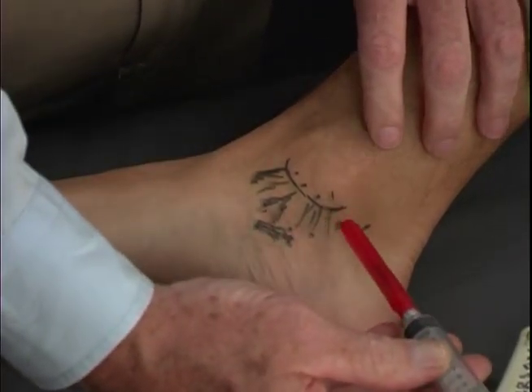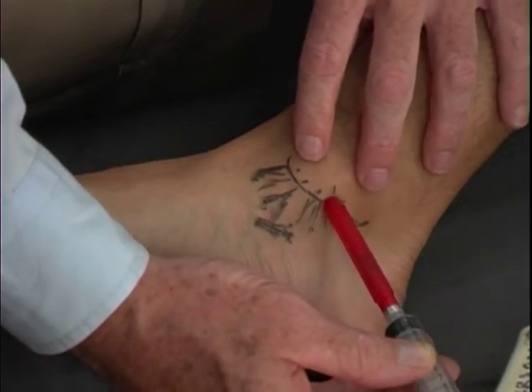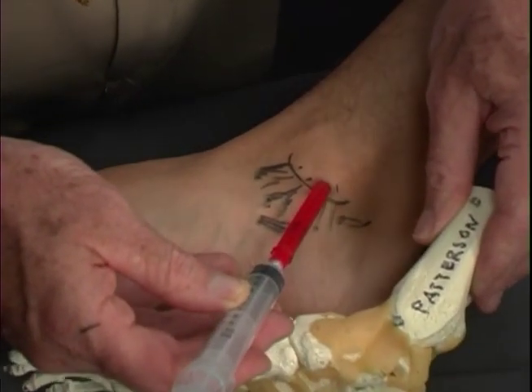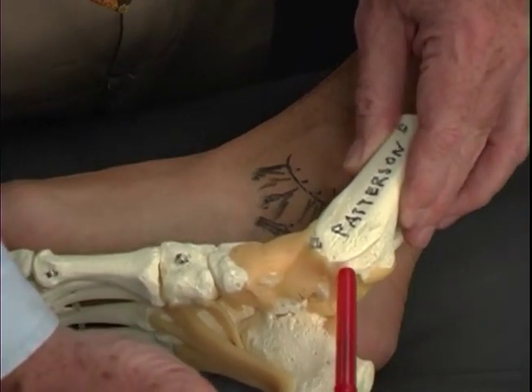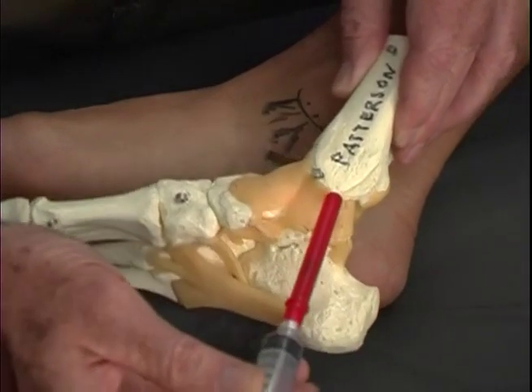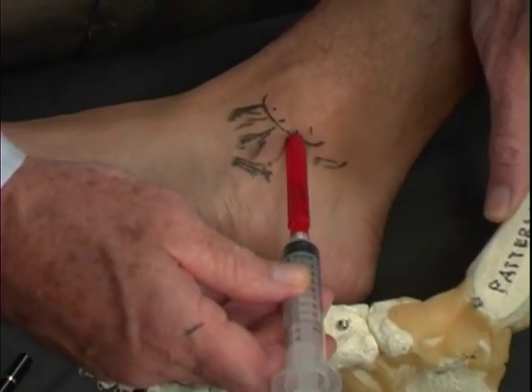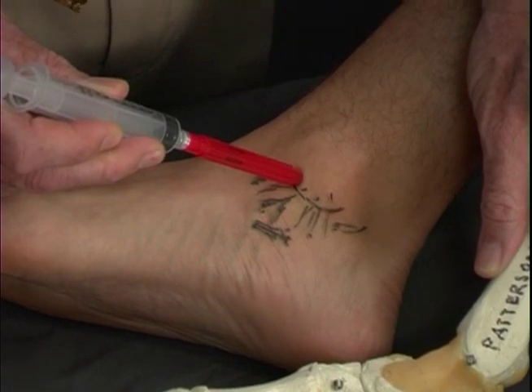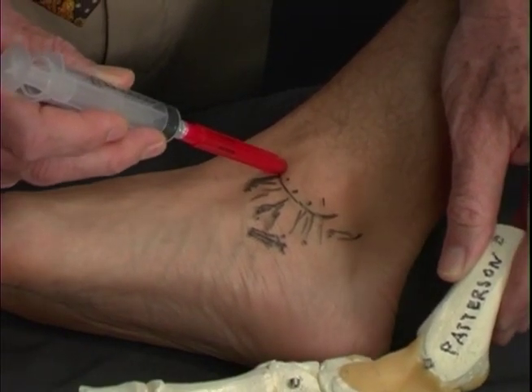The angle of our injection to do the inferior border of the malleolus is superiorly. And again, we have to imagine as we go the angle that we're doing on the bone. In other words, coming upward and in so that we're going to hit bone as we do the injections all the way around the malleolus, up, and we have to change our needle angle to hit the particular portions of the ligaments that we wish to hit.